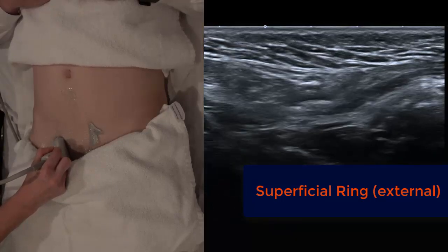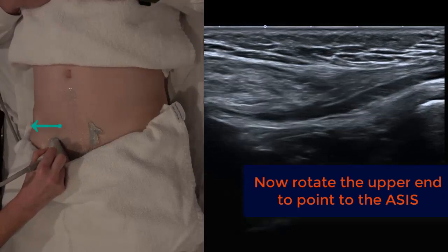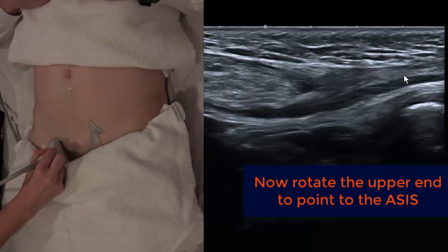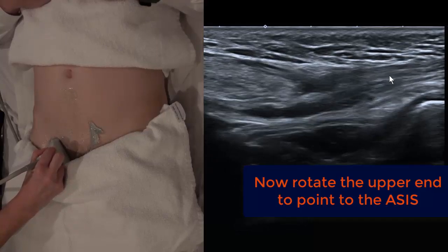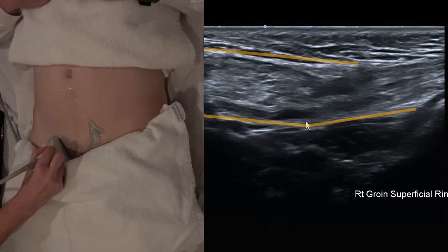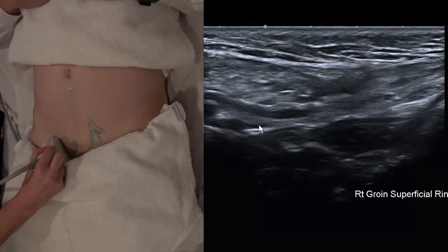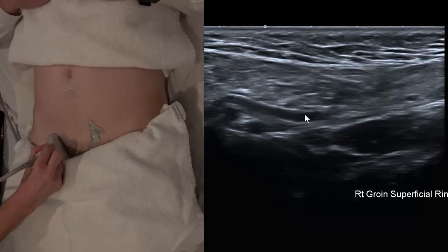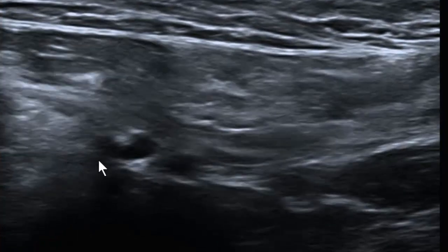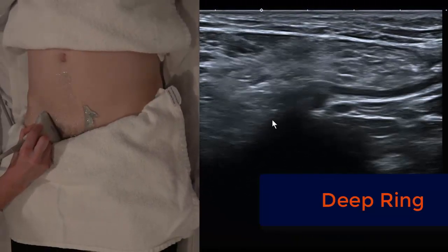Once aligned with the inguinal ligament, what you see is almost like an equals sign — two echogenic white lines running either side of the spermatic cord. Follow those slightly supralaterally, sliding the transducer maybe a centimetre further on. We've got an intact posterior wall of the inguinal canal and we're identifying where the veins drop into the abdomen. Where those veins drop into the abdomen, that's the deep ring.